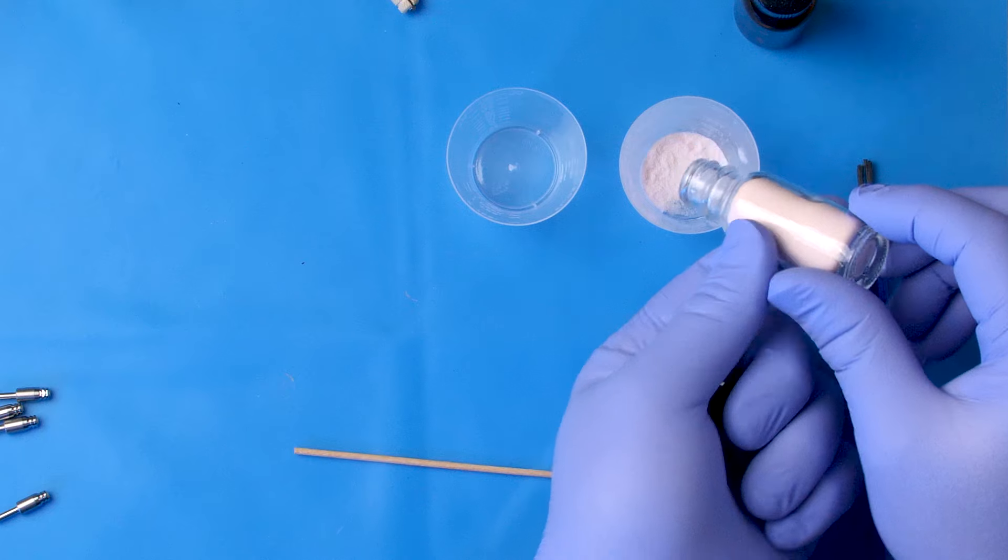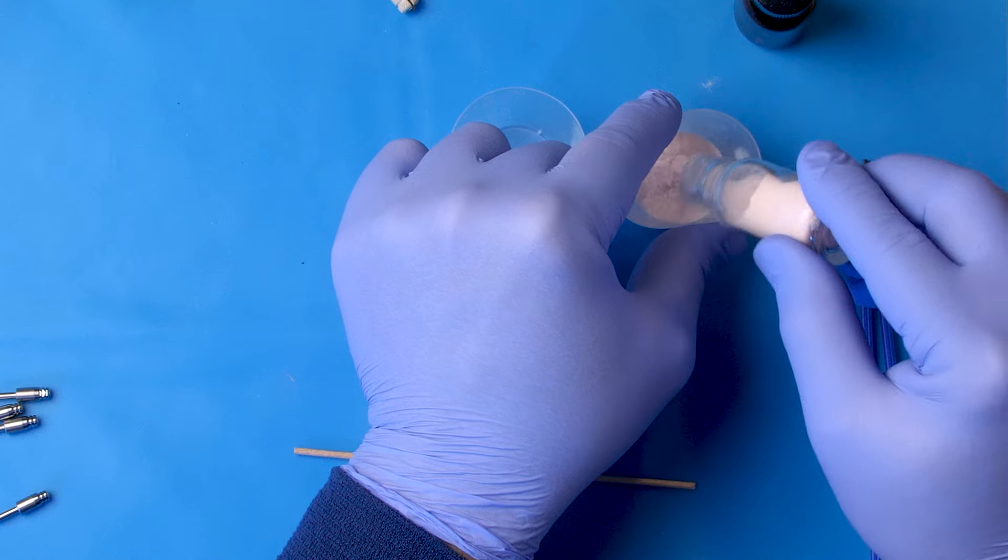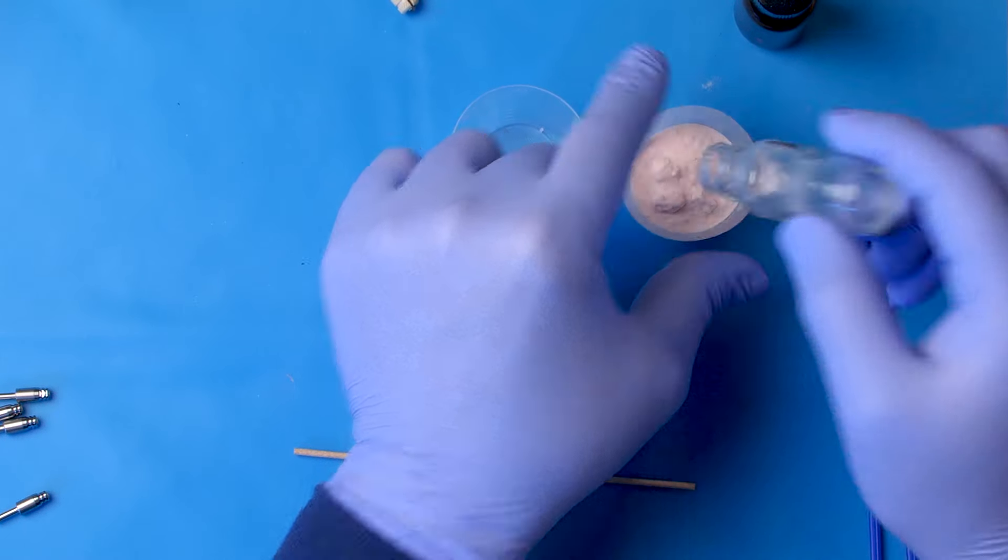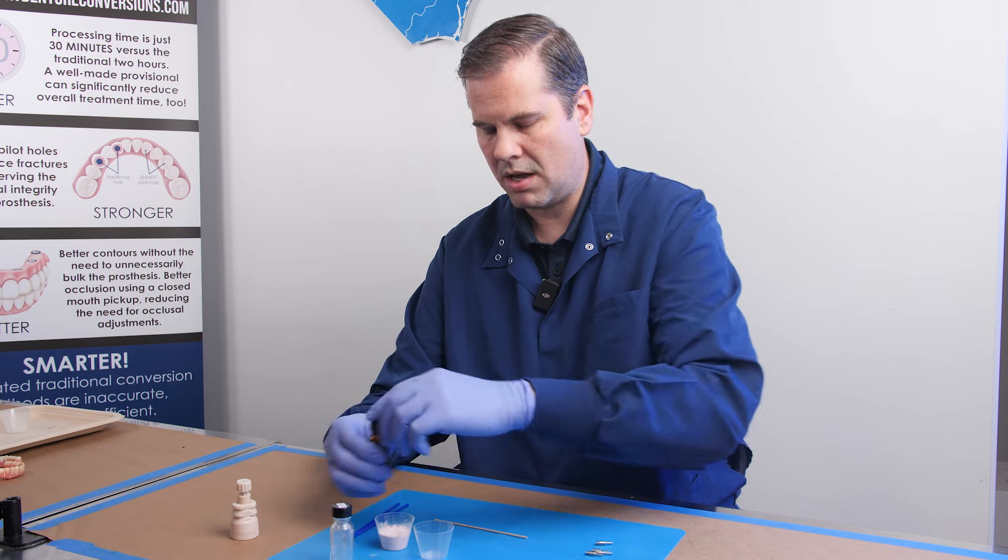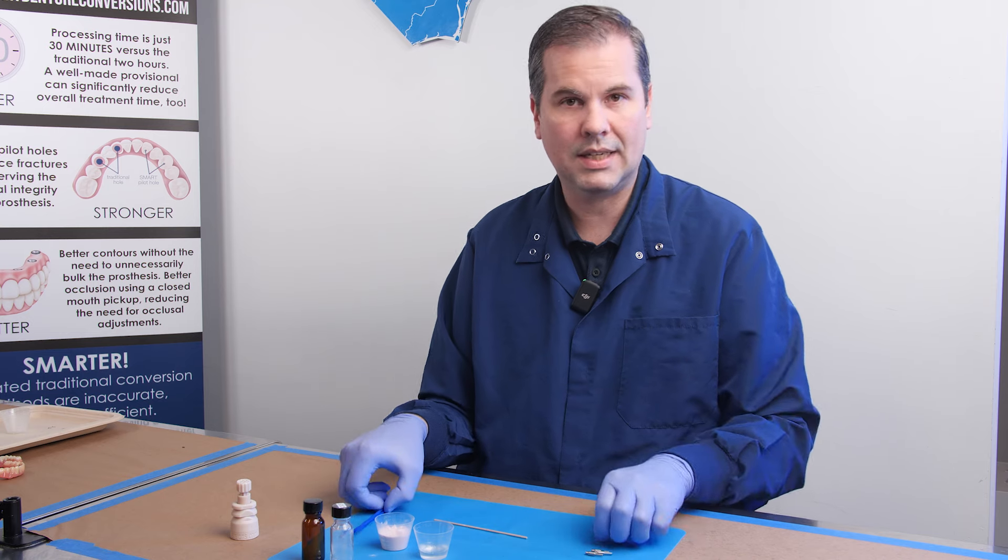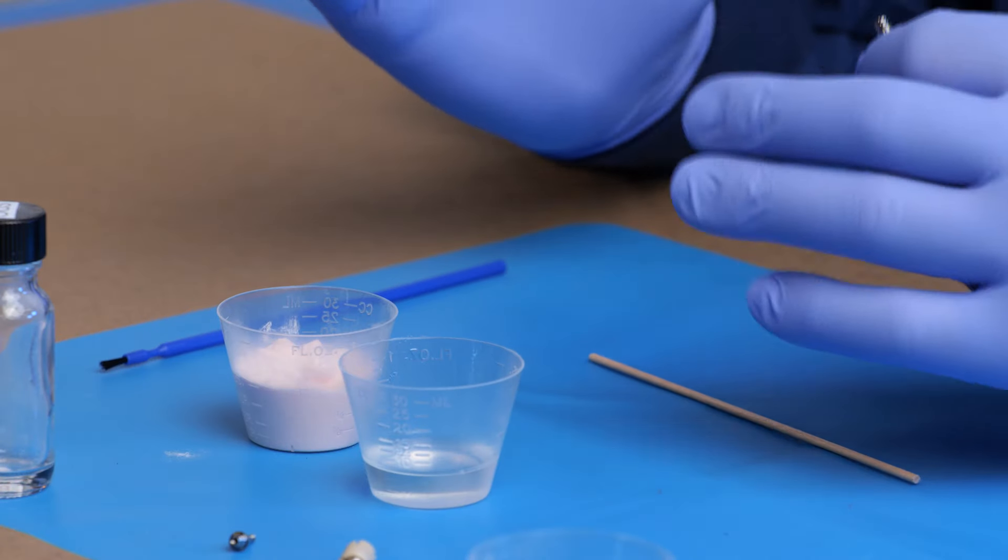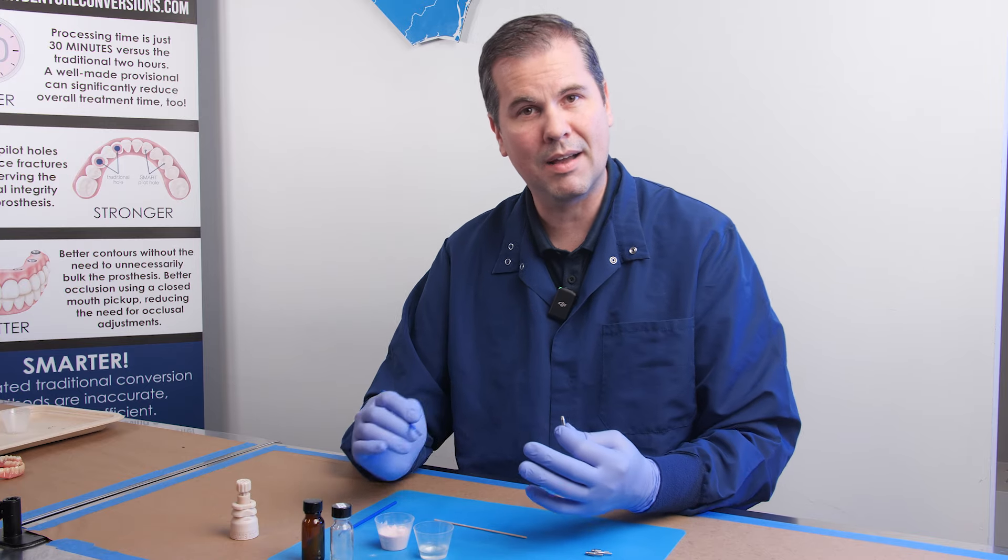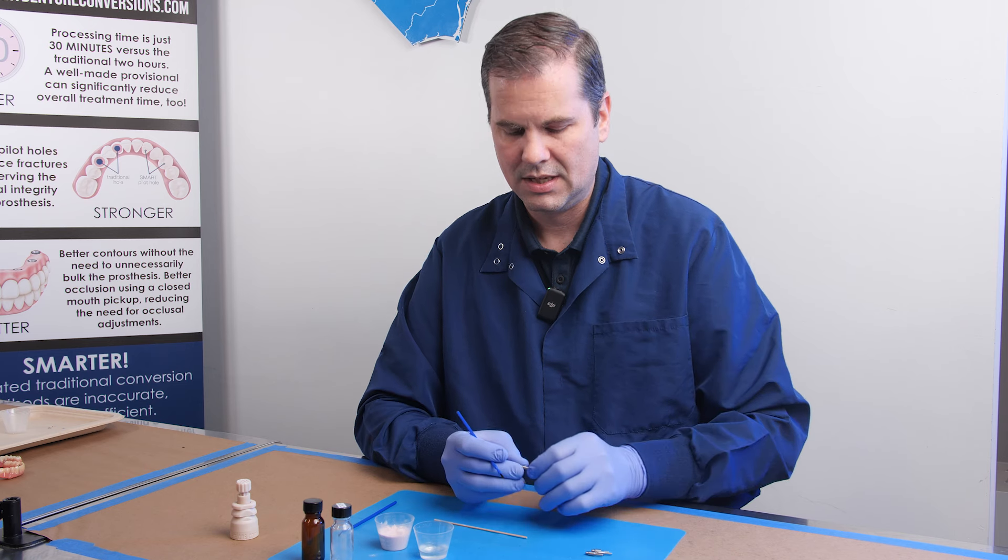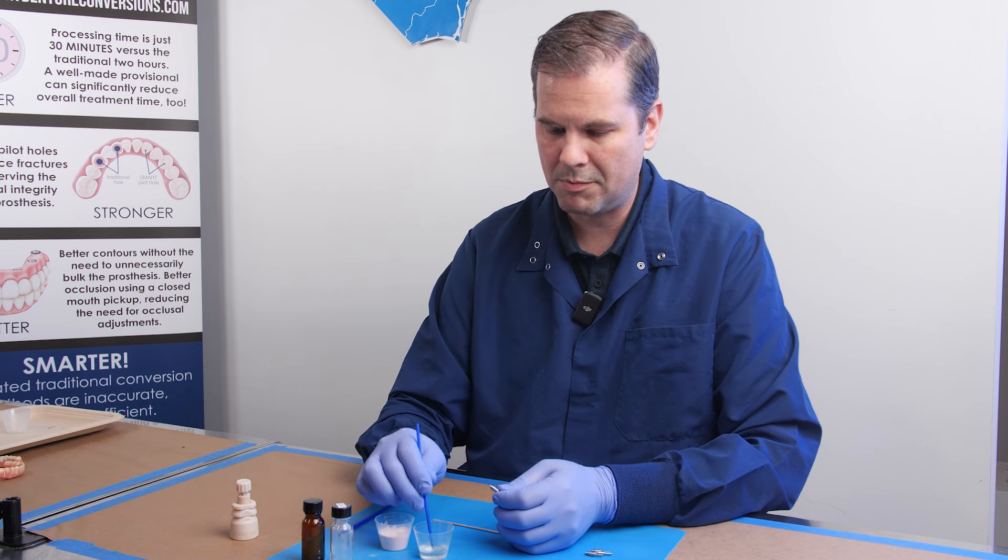Here I have my polymer and my monomer. Acrylic is my preferred material for doing a denture conversion because I like using a monolithic PMMA denture, which means if I do acrylic to pick up, then my pickup material is the same chemistry as the actual denture itself. So I'm a really big proponent of acrylic, monolithic PMMA dentures and using PMMA for my pickup material.